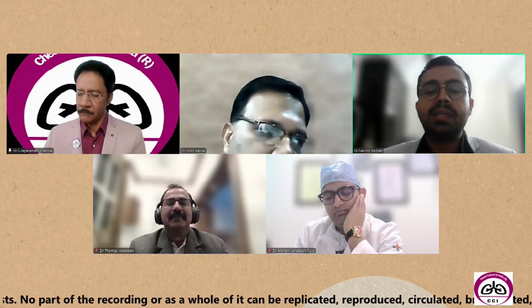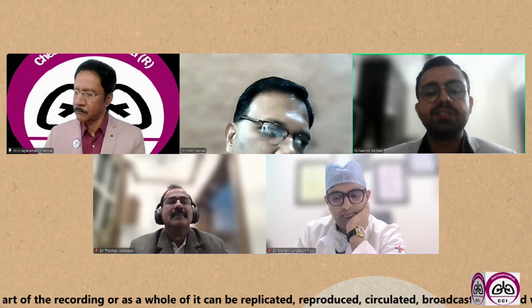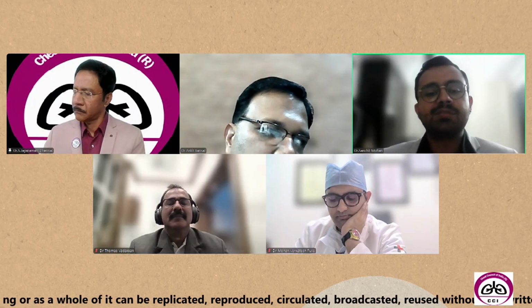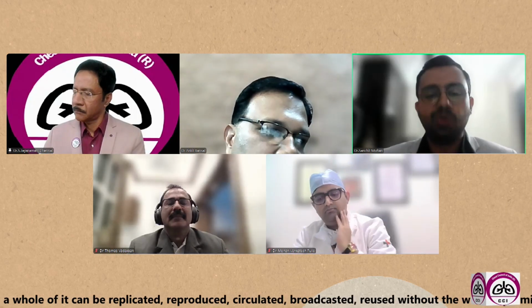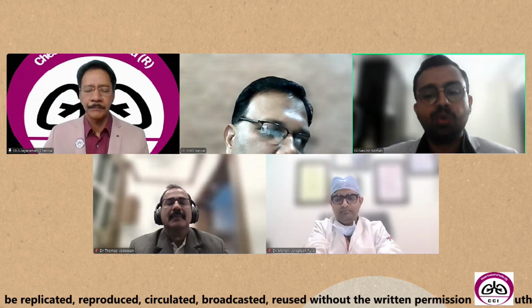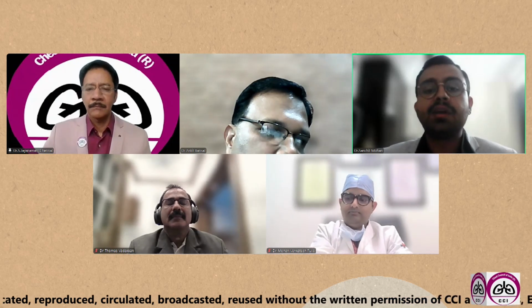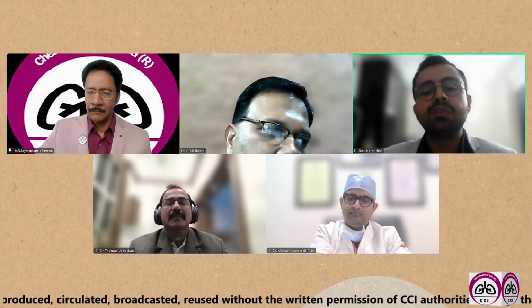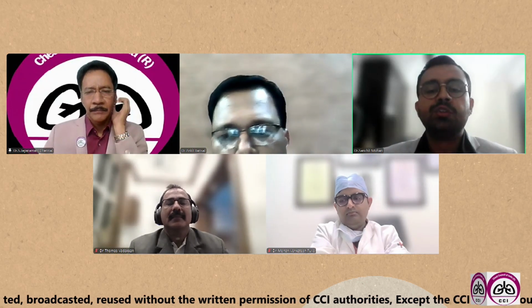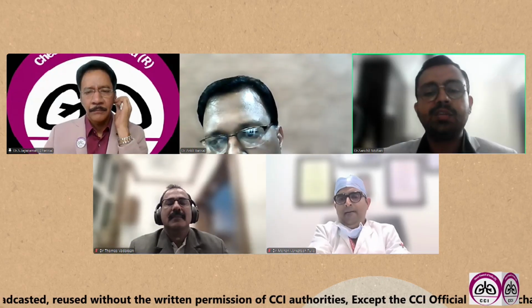There are some papers which have shown that we can sample station 5 and station 6 through the trans-aortic approach. So if we have a station 5 or 6, we can go ahead with the transvascular needle aspiration. It will be slightly difficult attempting these nodes from the trachea because of the cartilaginous structure of the trachea. So better would be to go into the esophagus.